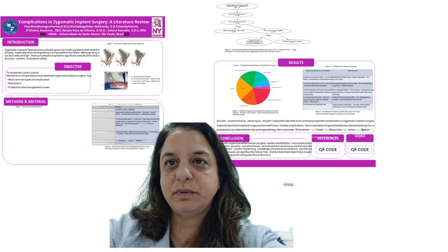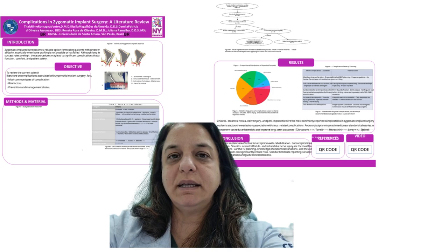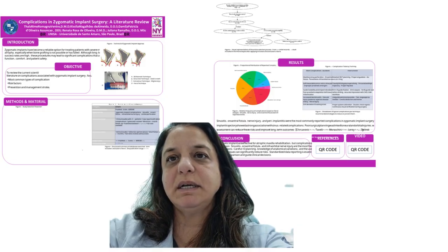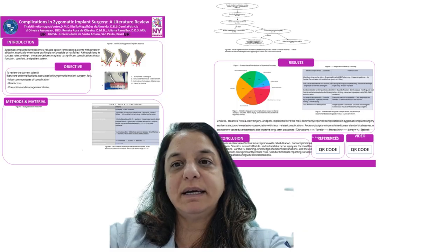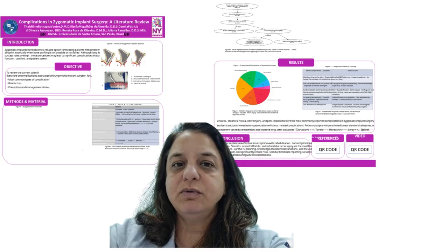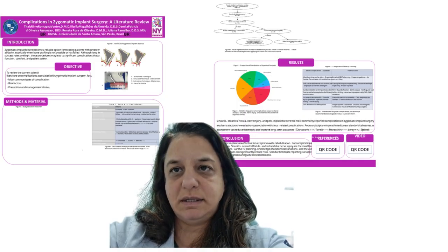Initially proposed by Dr. Brånemark, zygomatic implants required a sinus lift procedure. This was later followed by the technique introduced by Stella, which involved placing the implant into the zygomatic bone supported by a groove in the maxilla. Shortly after, the technique was improved by Dr. Melhorança, a Brazilian surgeon who developed the exteriorized approach, significantly reducing complications such as orbital floor perforation and sinusitis.